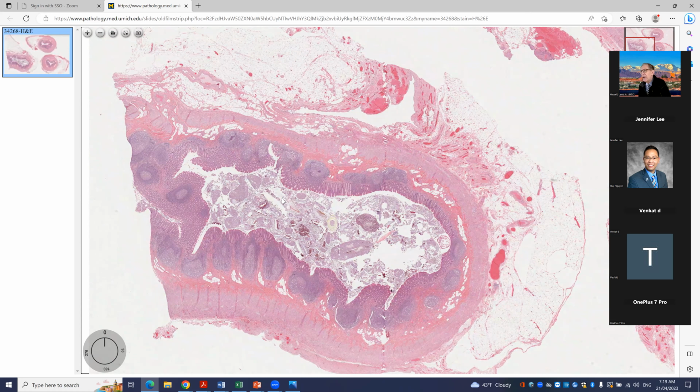Did any of you see the eggs in the feces? They weren't really evident here to me, so if you did, I was hoping that you might highlight those. Okay, well, let's go on to case number 2.